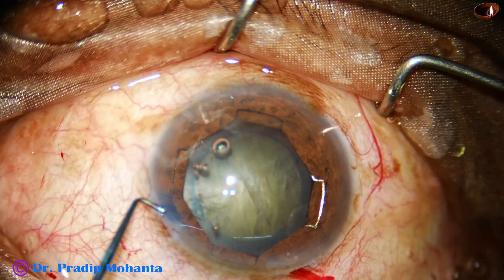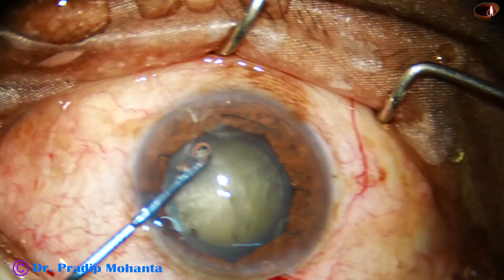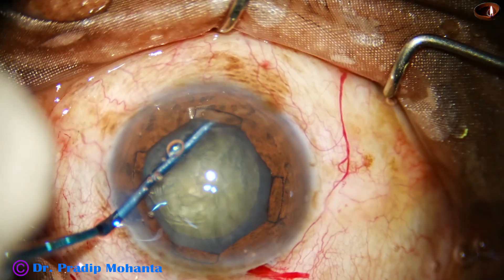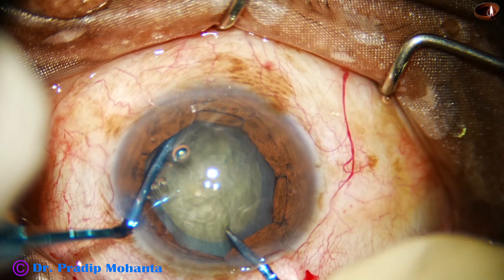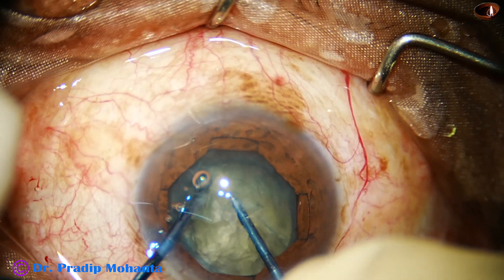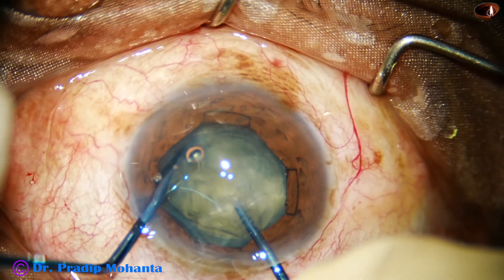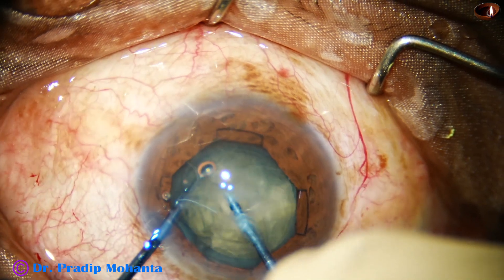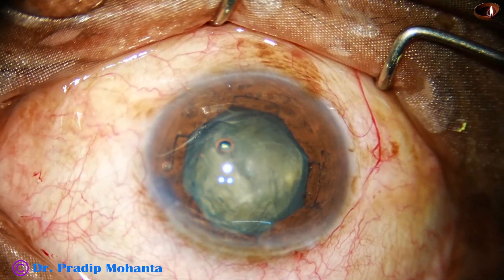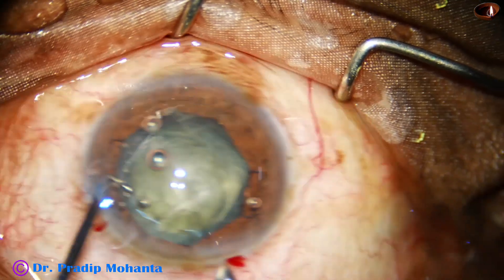Now I am going to use a pre-chopper designed by me. This is the pre-chopper with a ball tip at the end. The tip length is 1.8 mm. Through the main incision goes the pre-chopper — the front is cutting and also has a tip length of 1.8 mm. The sustainer hooks the equator, supports the lens, sustains the cataract, and the pre-chopper cuts the nucleus into pieces. We have divided the nucleus into four fragments. In soft cataract it is much easier; in grade 3 it tends to rotate a bit, but you can manage grade 3 cataracts with the pre-chopper.